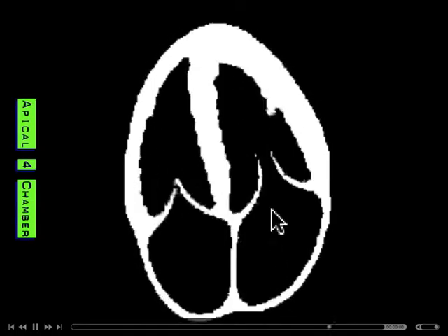By the way, the aortic valve is snuggled right up in here. We're going to get to that in a minute, but that's where the aortic valve is. So during systole, it's being pumped out of this LV, assuming there's not much mitral valve regurgitation. In other words, the blood is not going this way, but it's going right down into this little area that's out of the plane of view. It's a little bit more anterior, out of the plane of view, and that's where the aortic valve is.